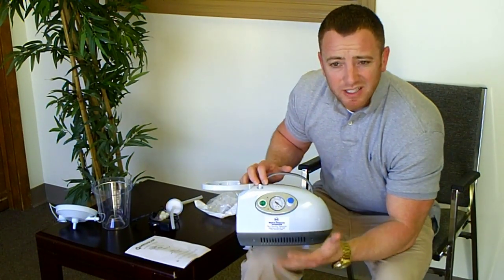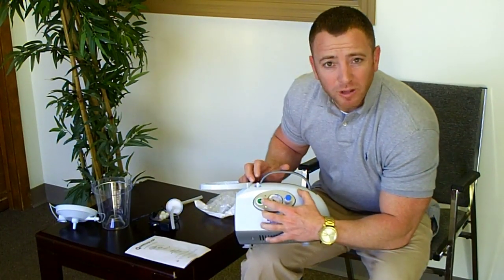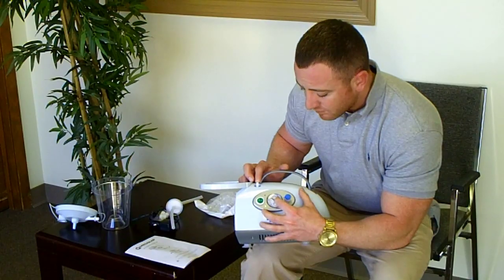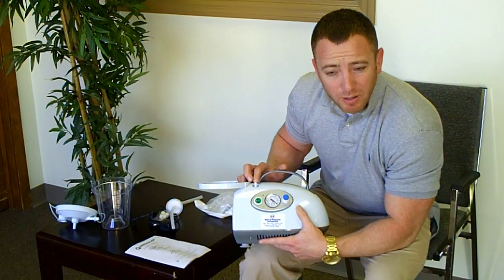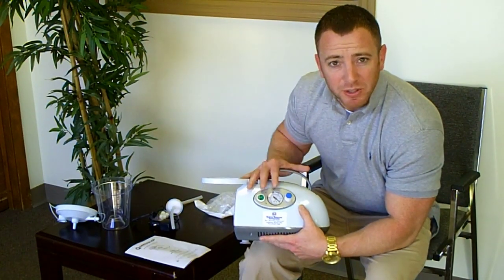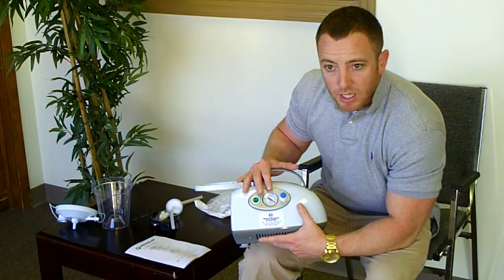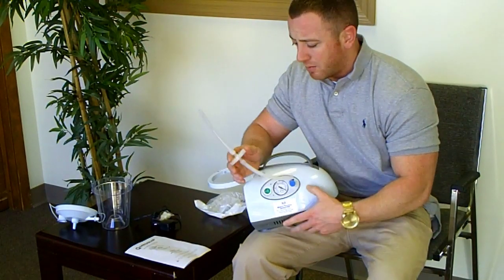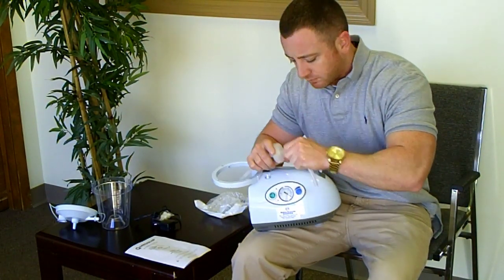Turn it on is here. If you ever think for whatever reason it's not sucking like it's supposed to, you want to put your finger over the hole and see if your gauge goes up. If your gauge does not go up when you do that, you have a problem with your suction machine and you need to get to your provider. If it does go up, then you probably have a different problem. It's probably going to be your filter.